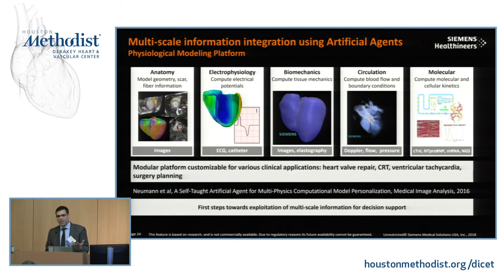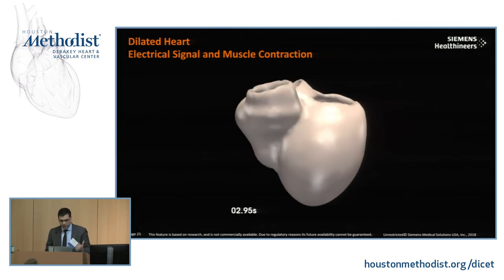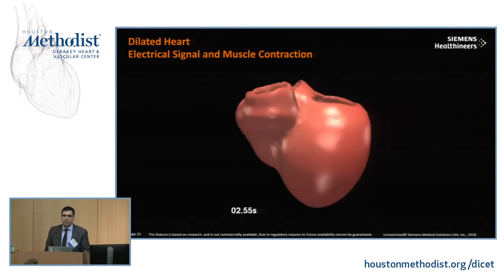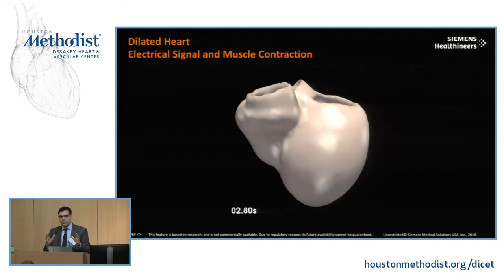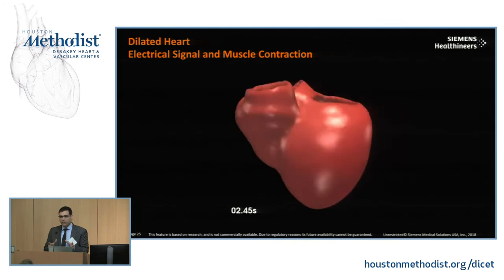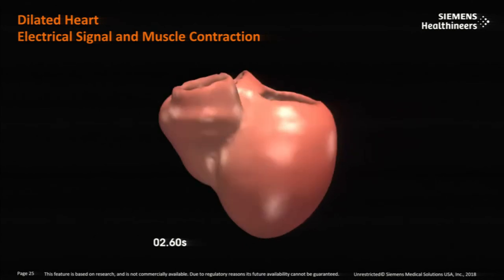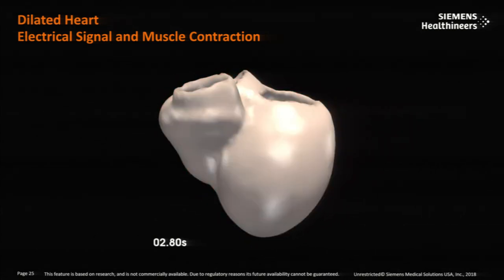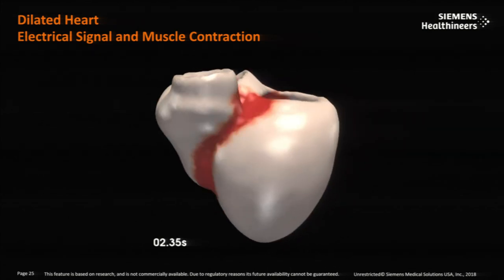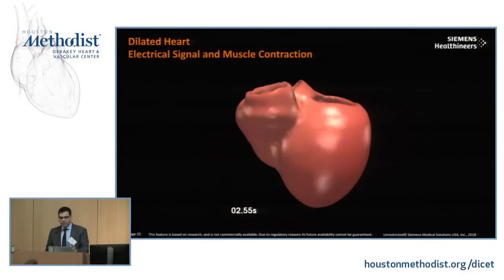And just to show you an example of what you could achieve with that, that was a case where we received MRI data, a 12-lead electrocardiogram, and the blood pressure. So from the MRI data, we automatically extracted the geometry, the strain, the substrate. From the electrocardiogram, we could estimate the electrical conductivity of the Purkinje system and of the muscle, and then created the beating heart by matching the volume curves and the blood pressure. So then we created this digital twin.